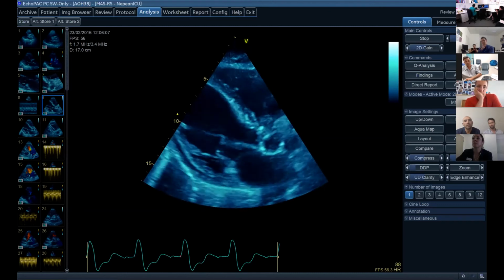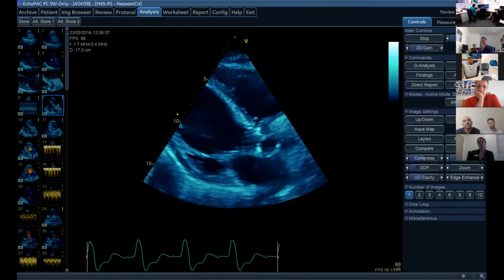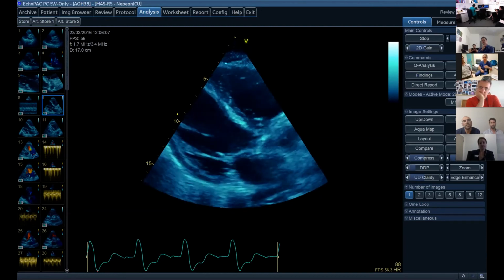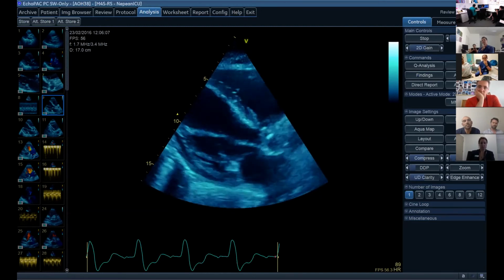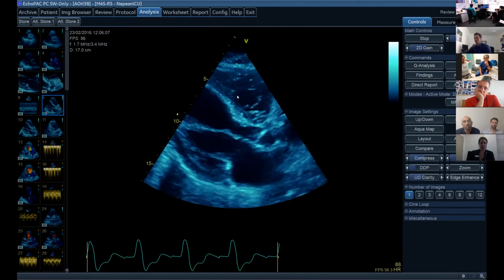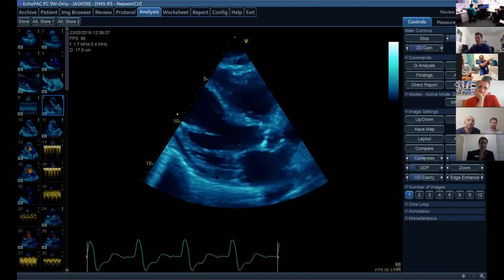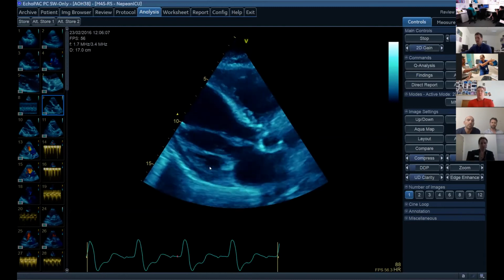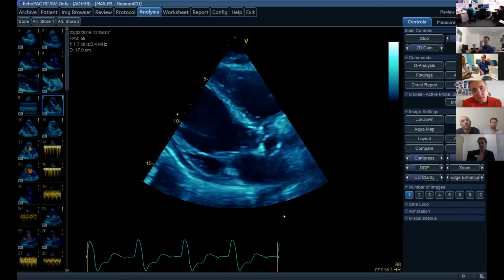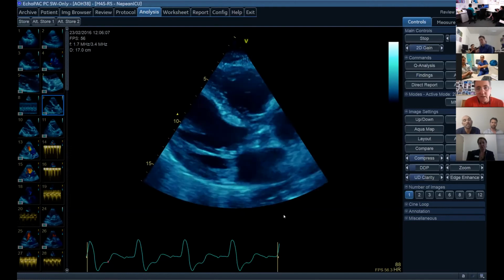What walls of the ventricles are we looking at here? So there's the septal. So, I'm never good at this. This is the anteroseptal, the basal septal, mid septal, and then posterolateral and basal. Mid and basal posterolateral walls.